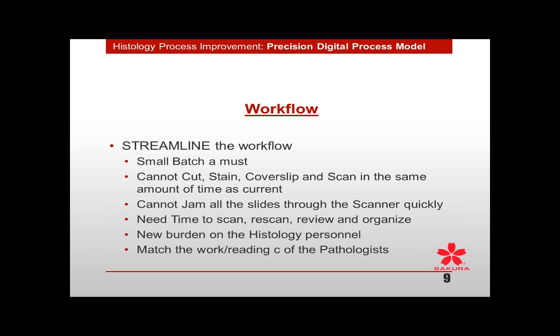The thing that I want you to get is that there are multiple steps in the manual histology process. We're now going to try to integrate those multiple steps into a new technology, which is digital pathology, which is more demanding and more precise. And then we have to keep it all within the total time constraint of whether you're going to be able to keep your normal turnaround time, whether that's 1 hour, 2 days, 1 day, what is it? Most often the expectation is that by adding this enhancement of information, we're not going to be extending any turnaround times.